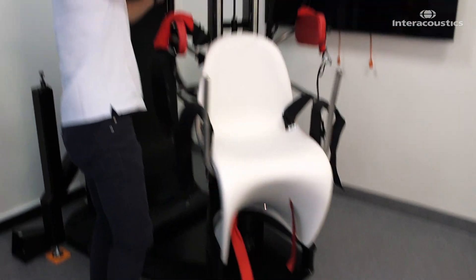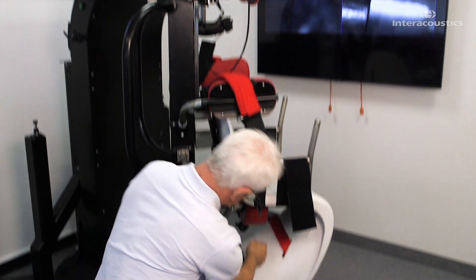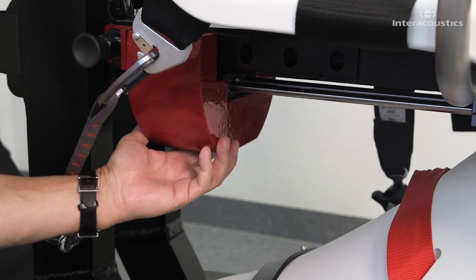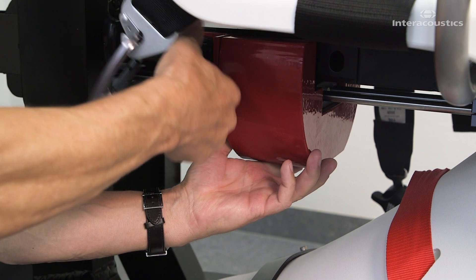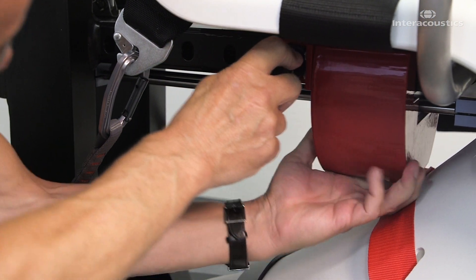Adjust the counterweight under the seat to match the weight of the patient. This will make it easier to maneuver the chair. In heavy patients, move the weight towards the back of the chair. In medium weight patients, put the weight in the center position. In light patients, move the weight towards the front of the chair.